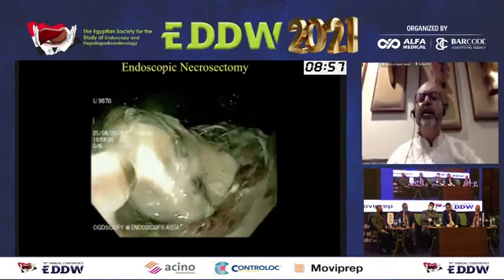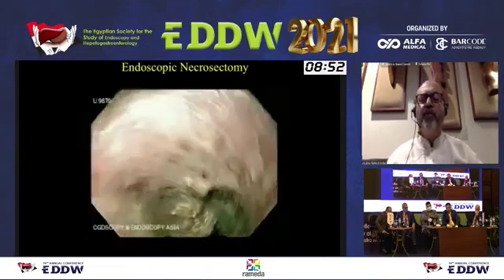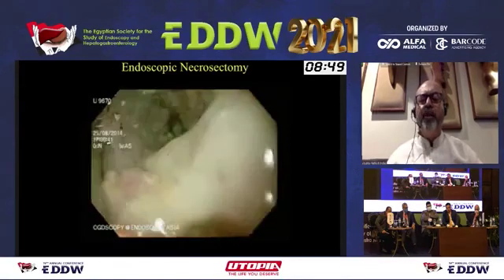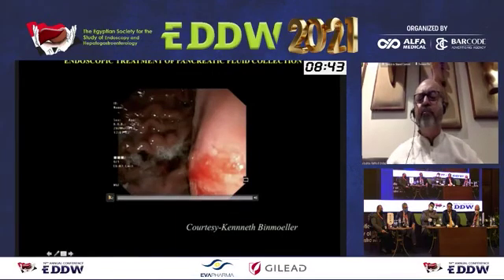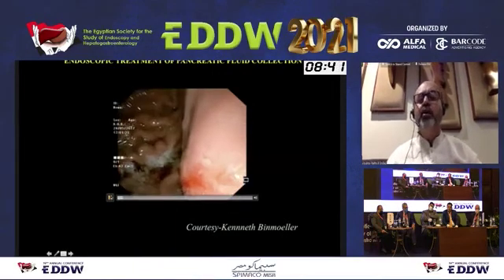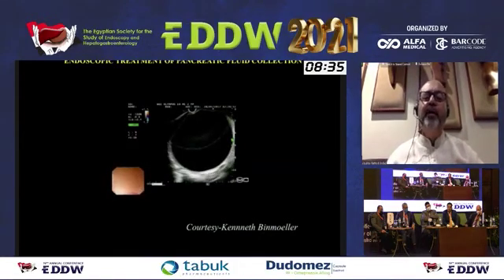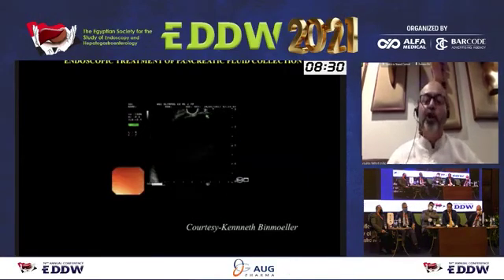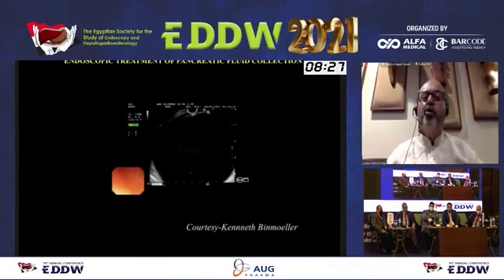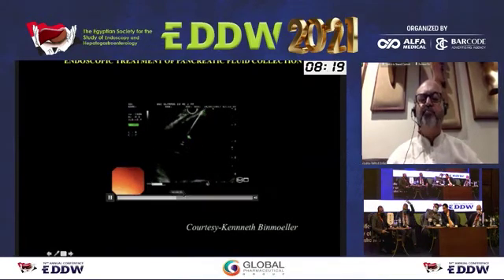If you ask me, if you choose the right case for endoscopic necrosectomy along with the percutaneous approach, this is still probably one of the best approaches for a better outcome in these sick patients. Coming to more advancements, I'm indeed grateful to my mentor, Ken Binmoeller, who is the developer of the Hot Axios, as we all know. I feel that this particular platform is probably the only dedicated platform for EUS guided intervention currently. With the Hot Axios, you can just deliver under one puncture, and in 5 minutes you are draining the fluid collection.